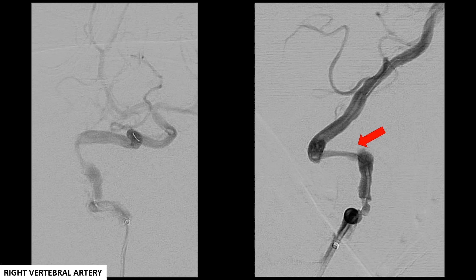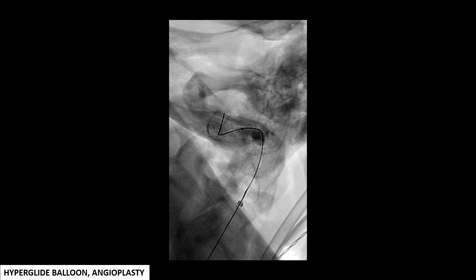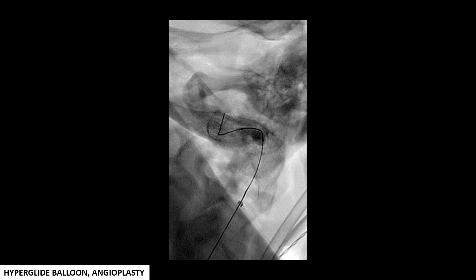Right vertebral artery injection following pipeline deployment demonstrated persistent but improved stenosis. Angioplasty was subsequently performed with a HyperGlide balloon, which significantly improved filling through the right vertebral artery.